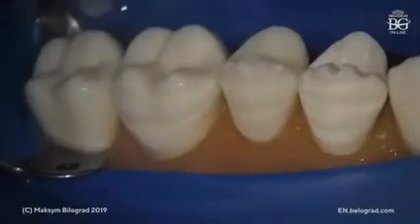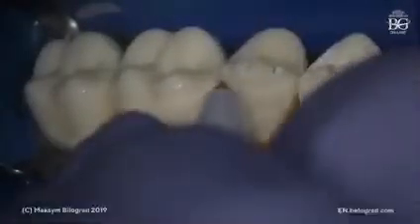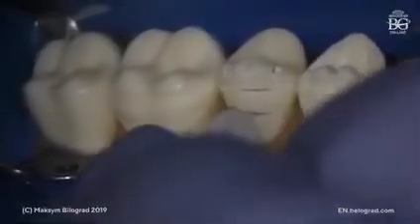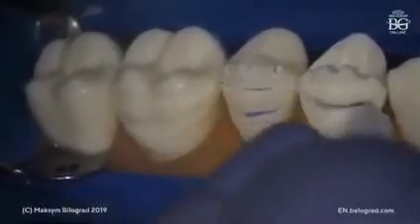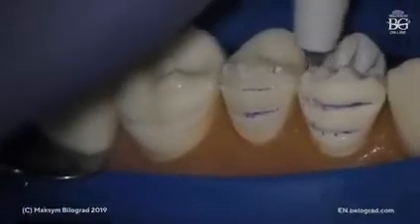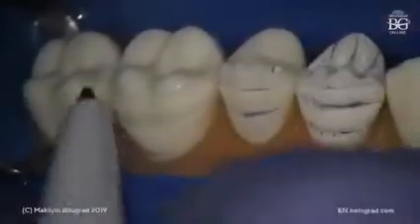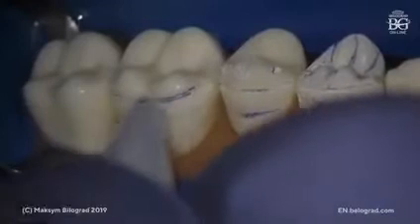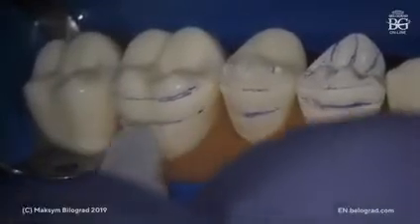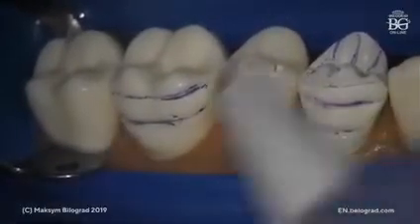It will be easier for you to determine the depth of preparation. Okay, so we mark all these lines, all these grooves, occlusal surface also, so that we will be having less problems in orientation. It will be easier for us to determine amount of our preparation. Okay. As I mentioned before, we're using mock-ups for preparation as well.